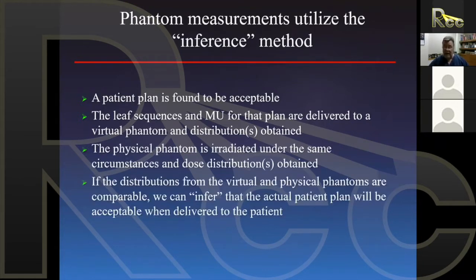If they match or they're comparable, we can infer that the actual patient plan will be acceptable when delivered to the patient. So this is basically a very simplistic way of looking at it.